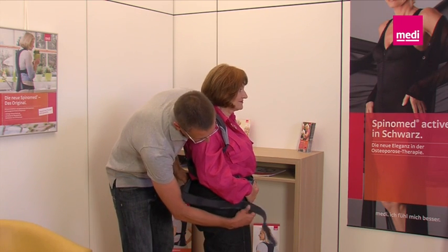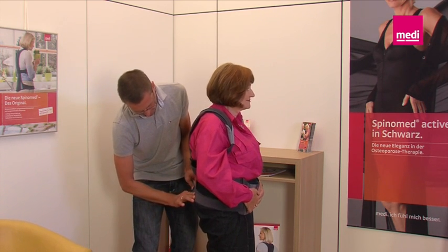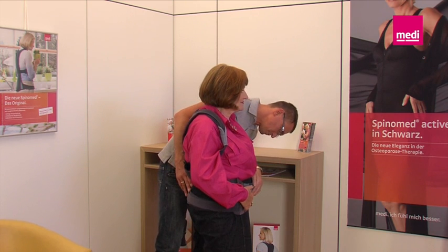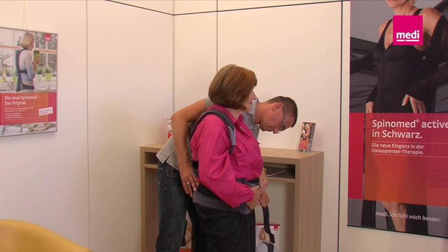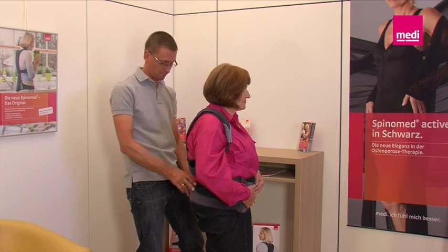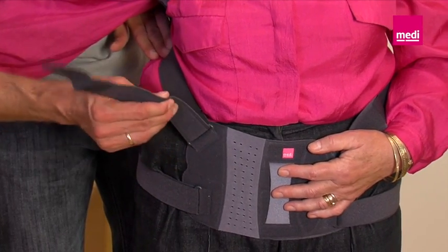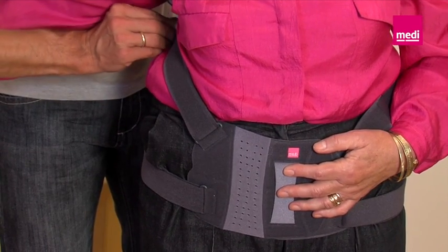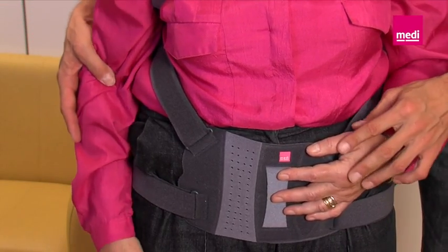Now pull the lower waist straps on both sides tight, one after the other, so that they fit to the body. This can initially be done provisionally — the straps should not be trimmed at this time. Continue with the adjustment of the straps by setting both shoulder straps to the right length. Pull the shoulder strap tight using the strap loop. Always ensure that the brace does not slip and that both the front pad and the back rod are positioned correctly.